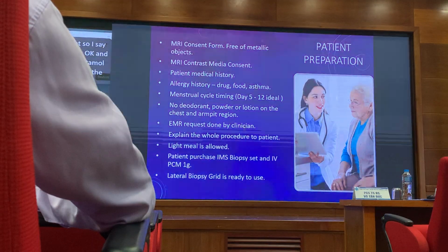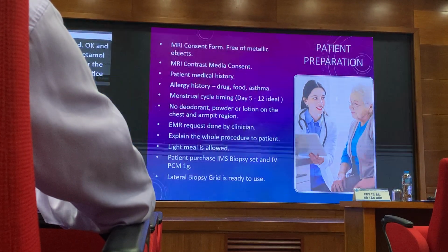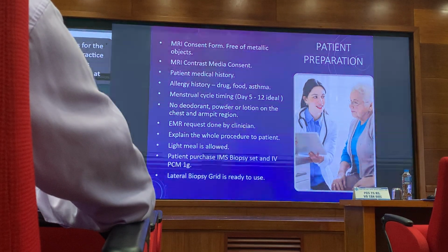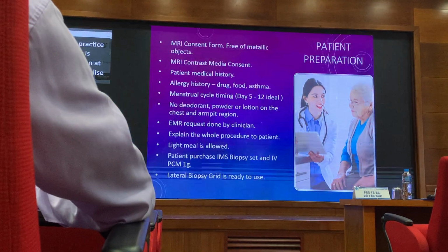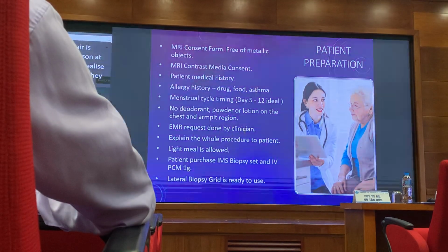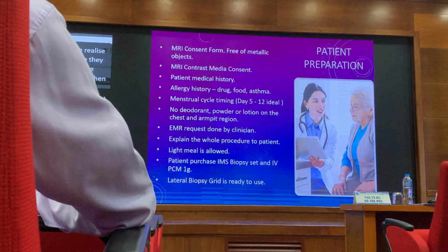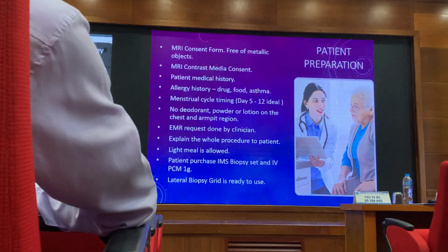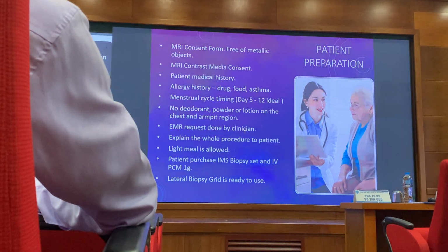What we practice is, ideally local anesthesia at the breast is good enough, but we realize that for most patients LA is inadequate. They need another IV paracetamol 1 gram together for pain management. And also we use the lateral biopsy grid, which replaces the plate that we used for the MRI breast just now.